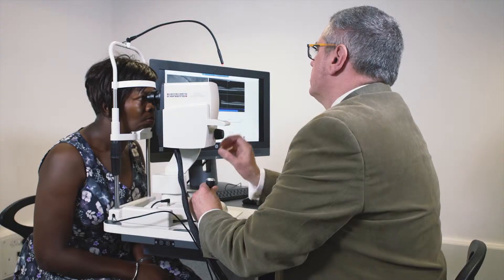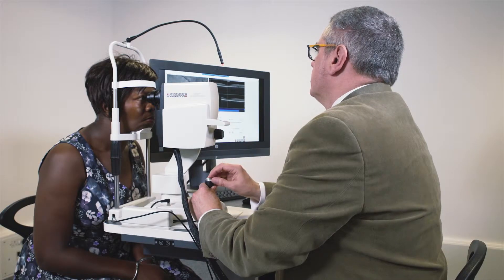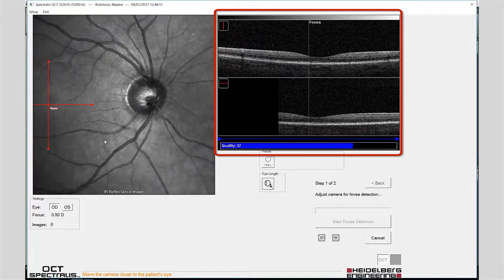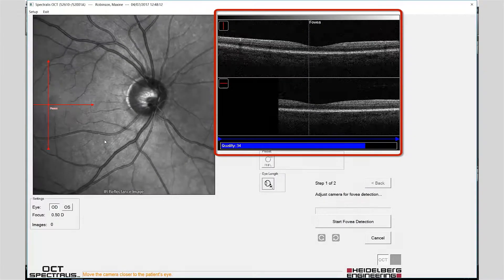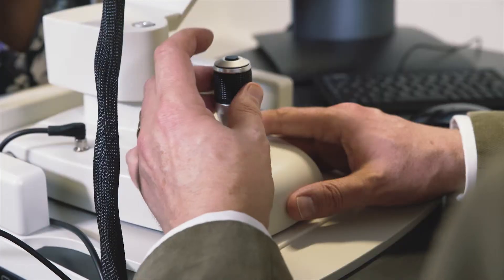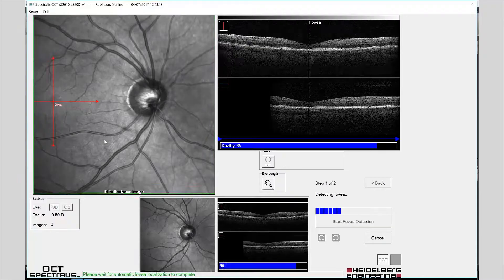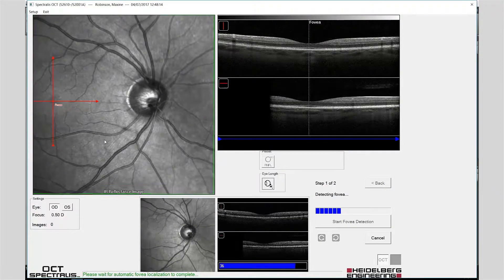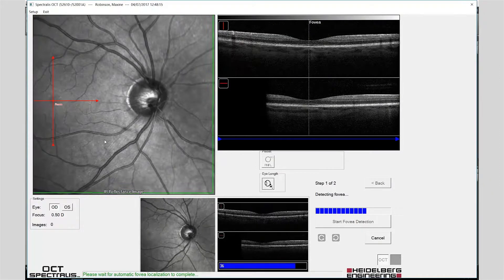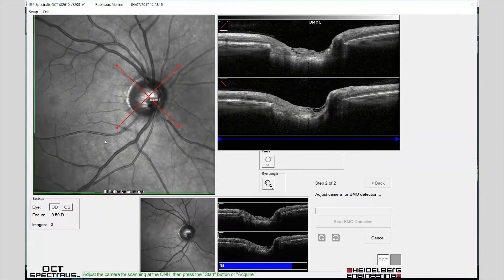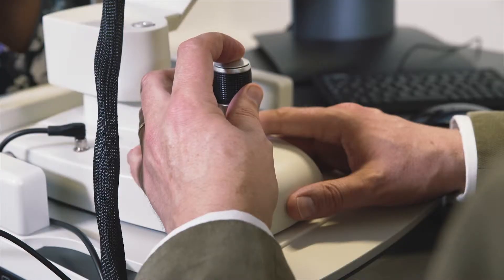When the OCT image is positioned correctly in the right-hand window, start the foveal detection with a single press of the joystick button. Start BMO detection with a second press of the joystick button.